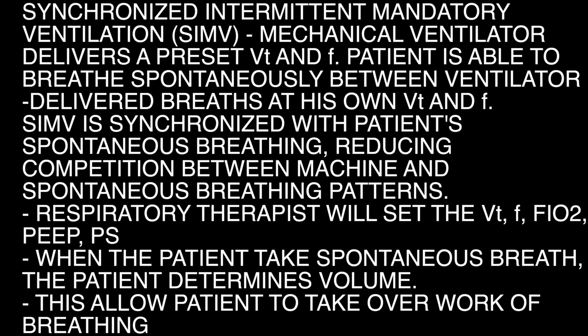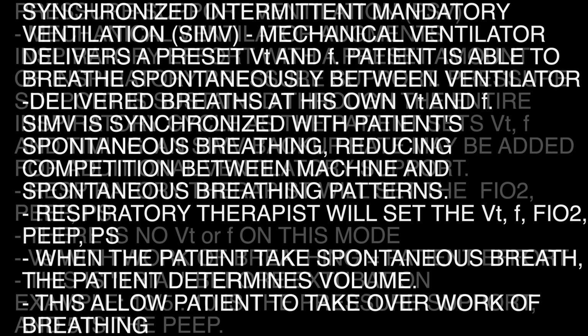The respiratory therapist will set the VT, F, FiO2, PEEP, and PS. When the patient takes a spontaneous breath, the patient determines the volume. This allows the patient to take over the work of breathing.